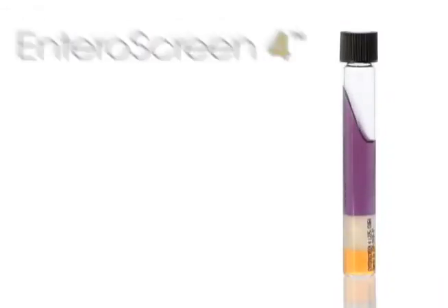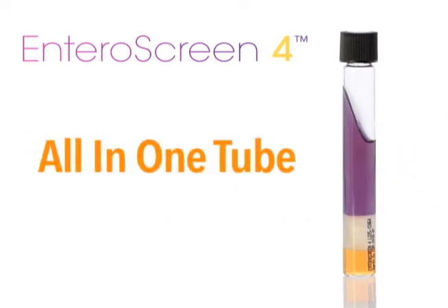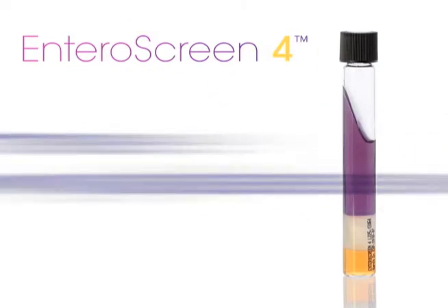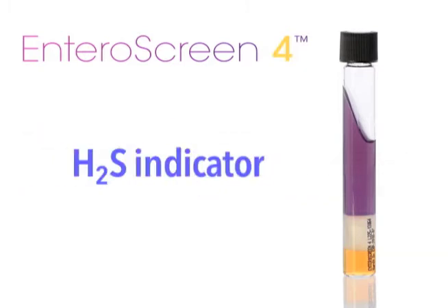To do the screen, Enteroscreen 4 gives you four biochemical reactions all in one tube. Those are lysine decarboxylase, lysine deaminase, urease, and H2S production.